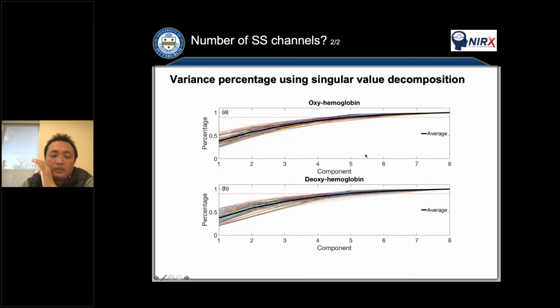This is only for short separation channels, so we use SVD from all channels. It looks like using 5 channels is enough in this data set. The 5 channels explain about 90% of the variance, so you can say that around 5 channels can explain 90% of the variance of the data.